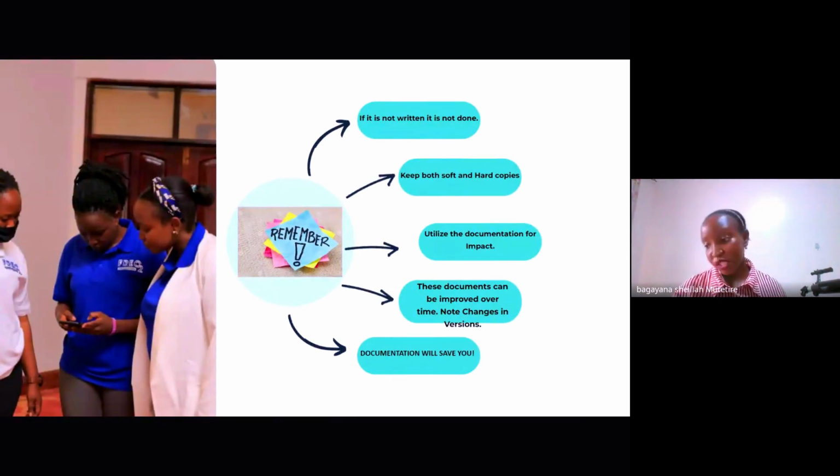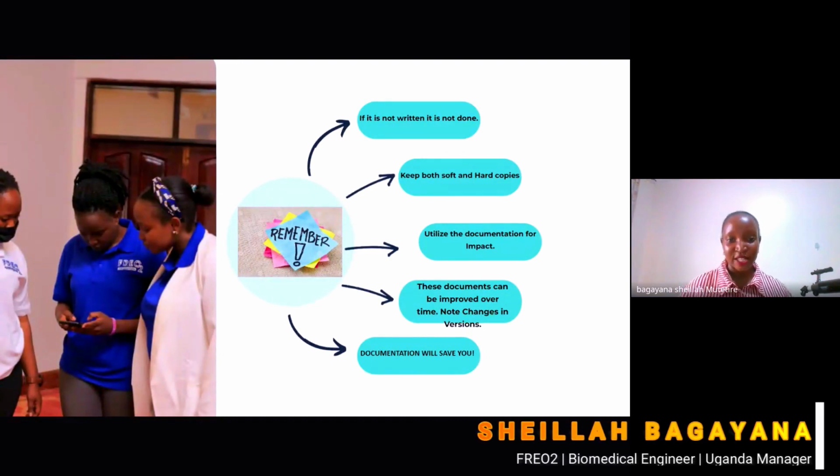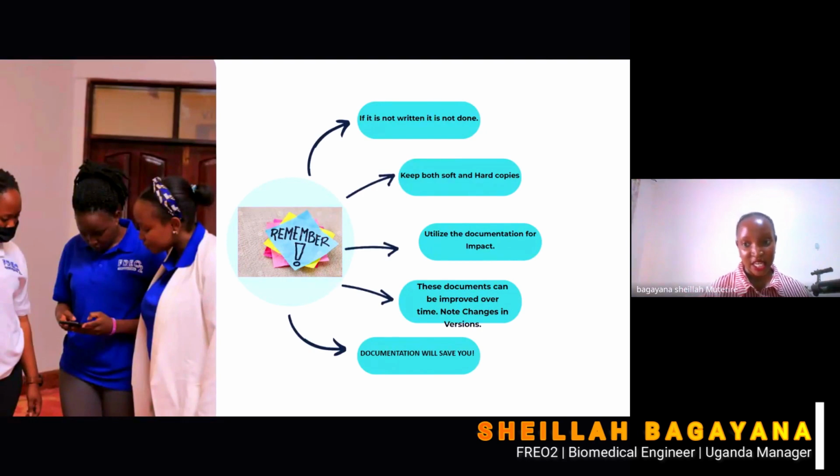And documentation will save you. So my colleague earlier mentioned that documentation is key for patient safety. And just in case anything ever happens to a patient, there is your backup plan to show that you as the engineer, as a biomedical engineer, you've done your part to maintain the device, to do all the best that you could do. So always have that to ensure that that's your backup in case anything happens.